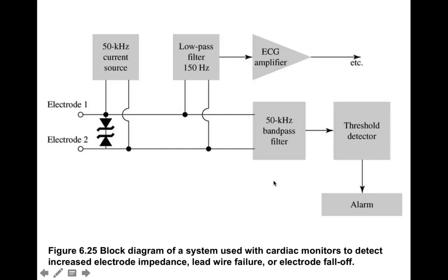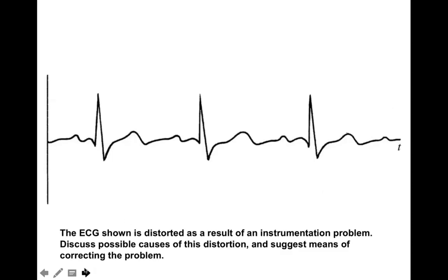The disadvantage of that obviously is a psychological one: the people monitoring the patient are very busy. They often have multiple patients. If they see that it's clearly a lead failure, I've seen them just hit the reset button on the machine and go on about their duties without actually checking on the patient. That's not anything anybody ever intends to do, but if you know you have a lead failure detection circuit, it's an easy thing to do when you're extremely busy. So that would be the one disadvantage, but there are lots of advantages to doing that.